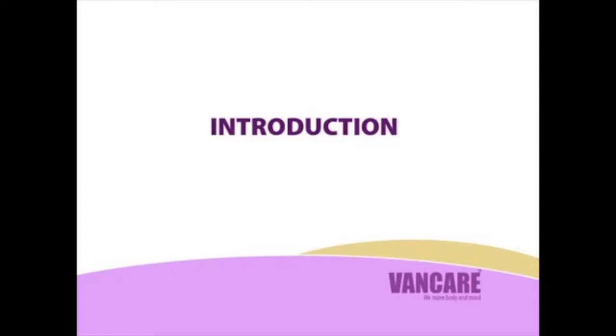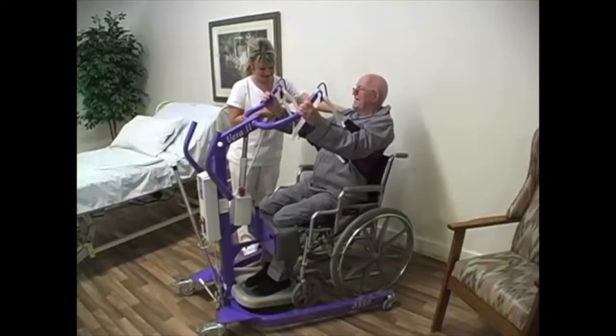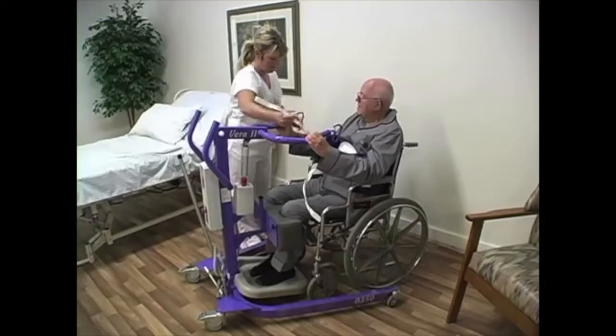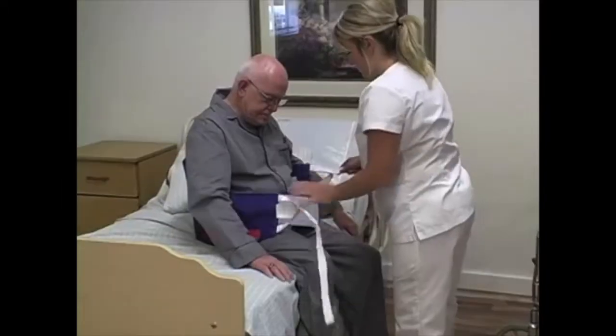Introduction. Mechanical lifts help make care easier on the client and less physically stressful for staff, thereby decreasing injuries that can result from transfers. The Vera Lift 2 can be used to transfer clients who require medium levels of care. Refer to the operation manual for client selection criteria.